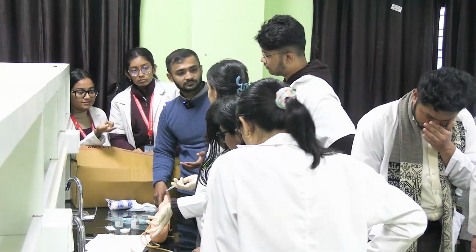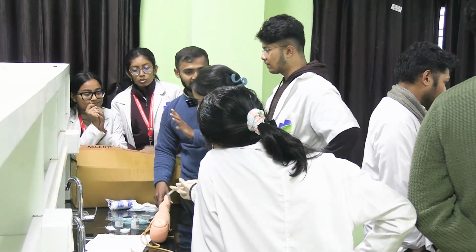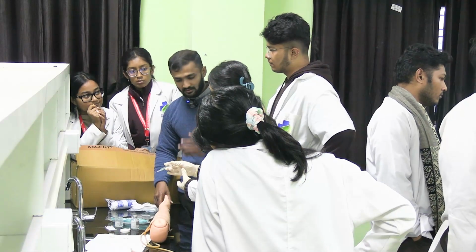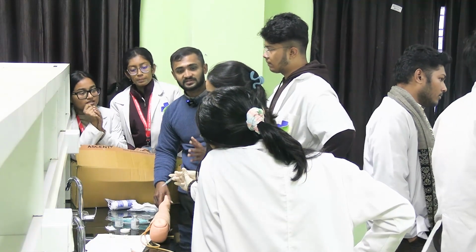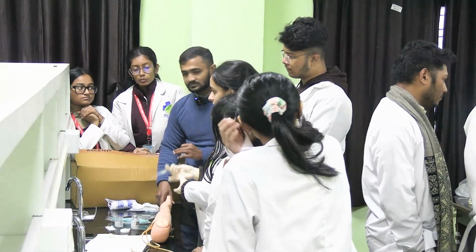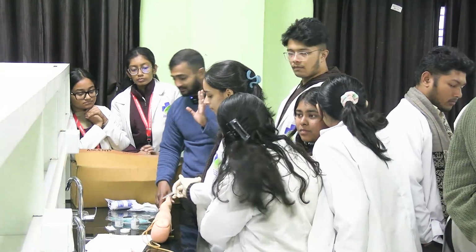Done. No, last I told you. Gloves, we discussed gloves also. Last, the surface area. No, last one. Sanitize, not sanitize, washing the hand. This was the last, isn't it? First was you started from the hand washing. Last also should be in the last step. Okay, probably you have done the Z technique.